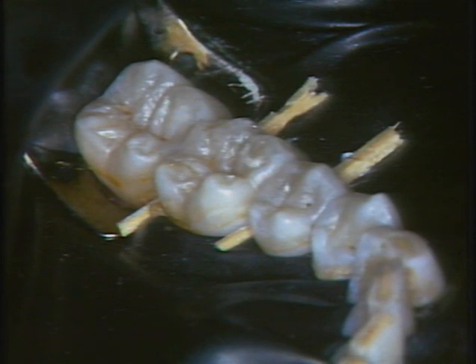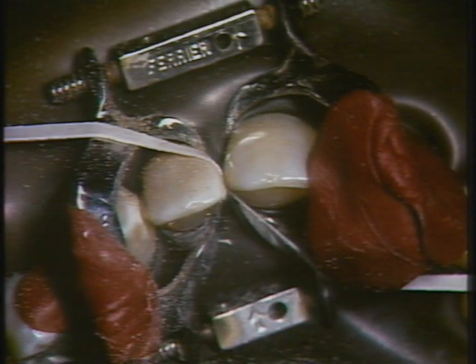A case presented itself of a cavity in a lower molar standing alone on the left side, in a mouth as wet as water gushing from every duct could make it. In a sort of half-desperate way, and partly to try the new idea, I cut a hole in my napkin protector, and over the tooth it went. There was the rubber dam.